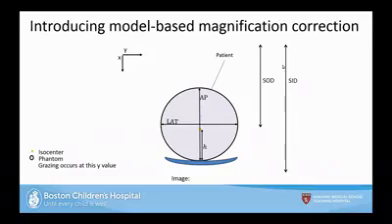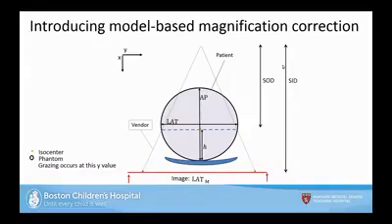So the vendor assumes that we want to do a magnification correction, but the vendor assumes that the patient is a flat line placed at isocenter. So it assumes that the X-ray actually grazes the anatomy at isocenter. But the edges here don't really represent the edge of the phantom when it's projected onto the image. If you can imagine that this would be the image and this would be the edge of the patient. So this is actually what they assume.